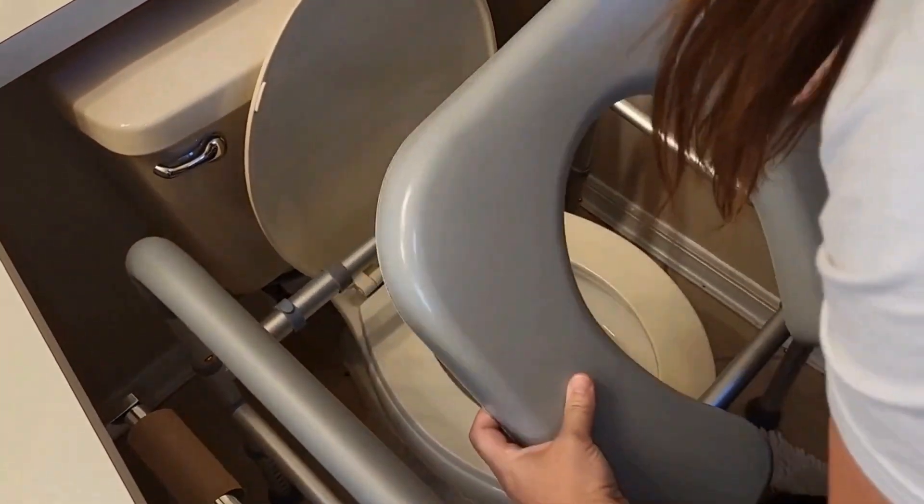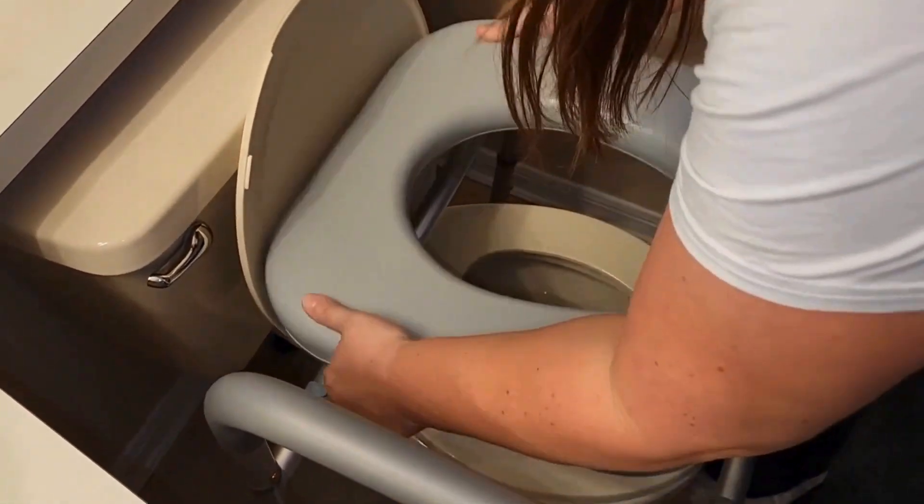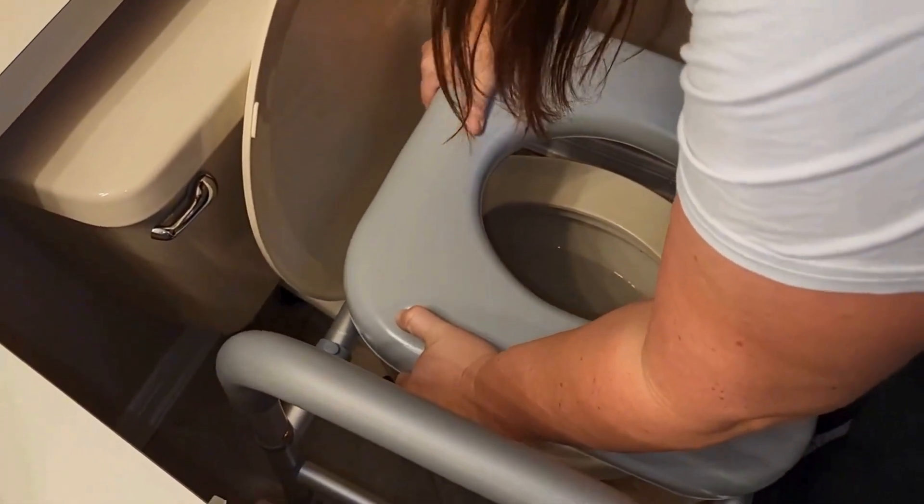As we put on the toilet seat, it really is just two snaps on the back as you can see, and you just snap it on there and it's ready to be used.